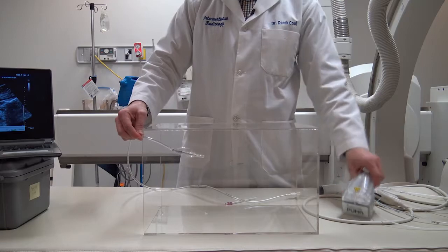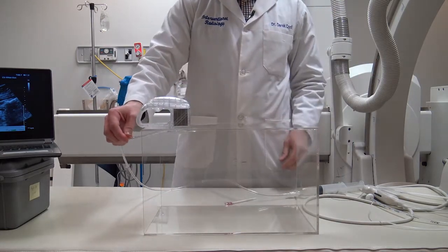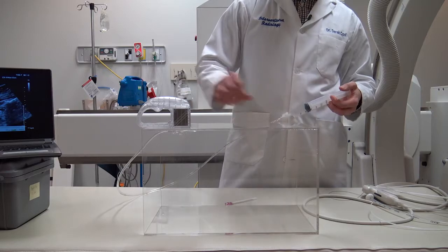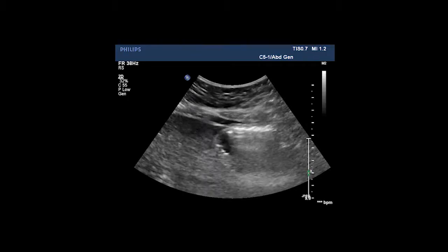And then we put another magnet just on the skin of the abdominal wall, and that pulls that balloon magnet up to the front of the stomach, and then we can fill that with water. And once it's filled with water, we can see that on ultrasound. That gives us a target to puncture with our needle.